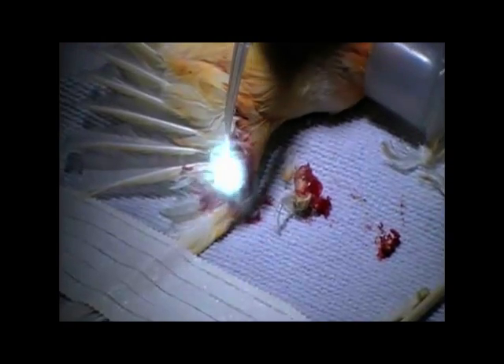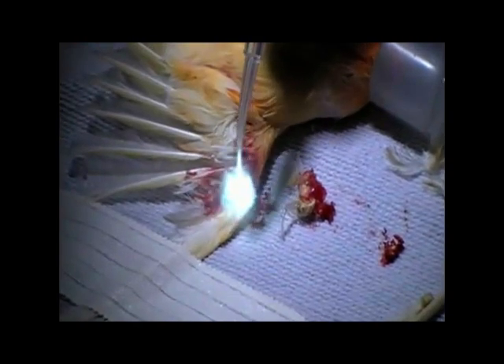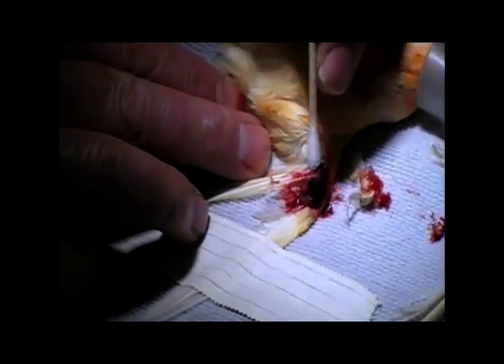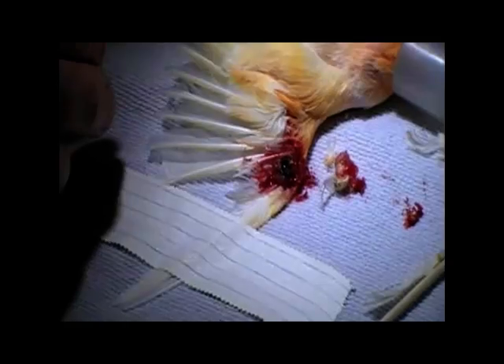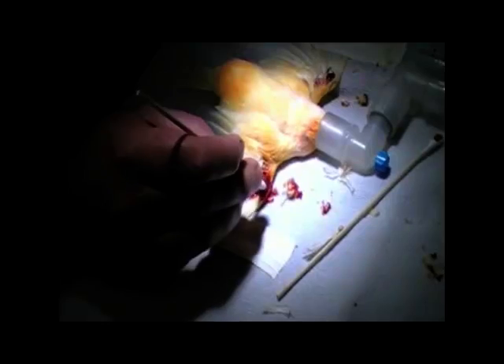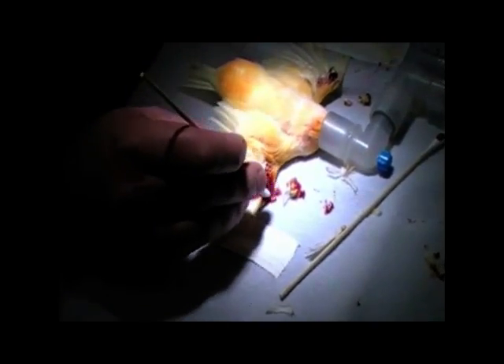Now I'll activate the laser to get that collagen to contract. There's something to close up now and I want that to all just stop up. I'm holding off about half an inch away from the spot and let that be just like that.